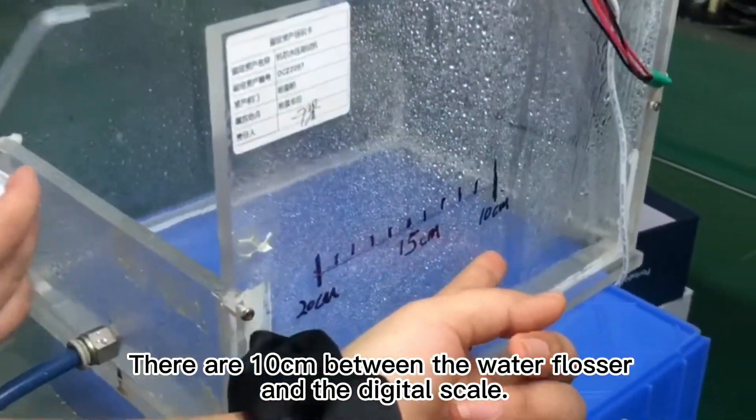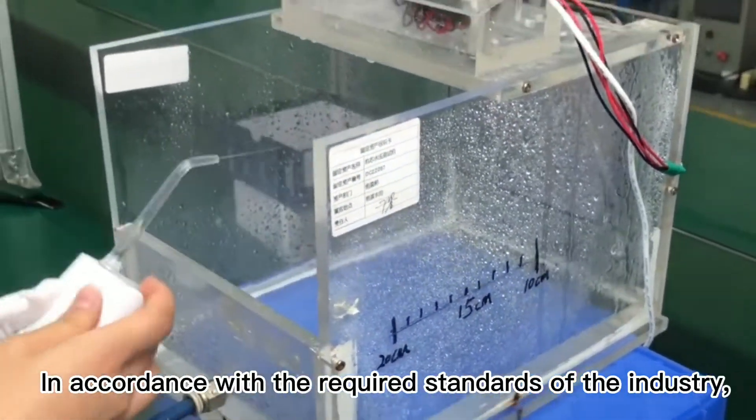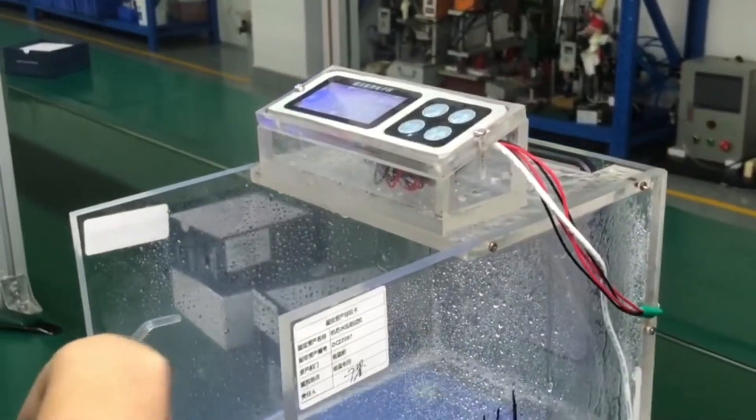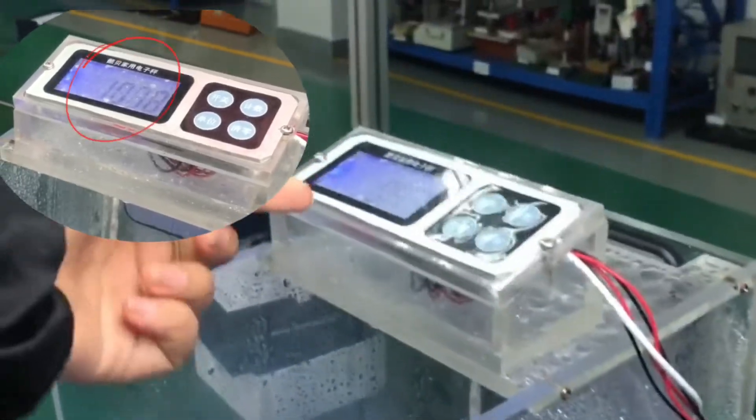They are integrated between the water flosser and the digital gauge. In accordance with the required standards of the industry, the maximum water pressure should reach over 11 bar.